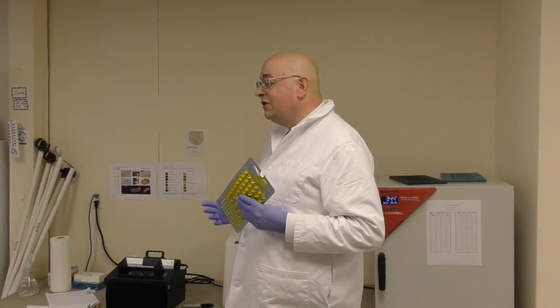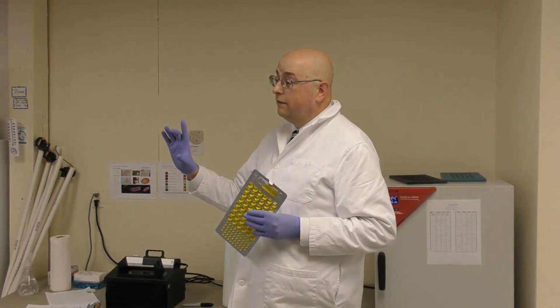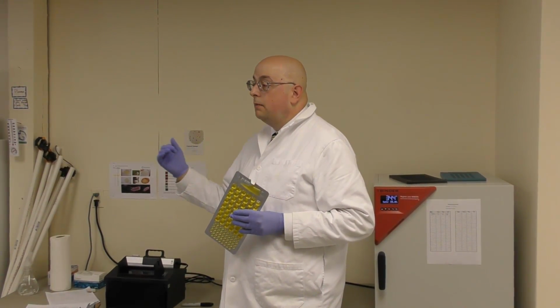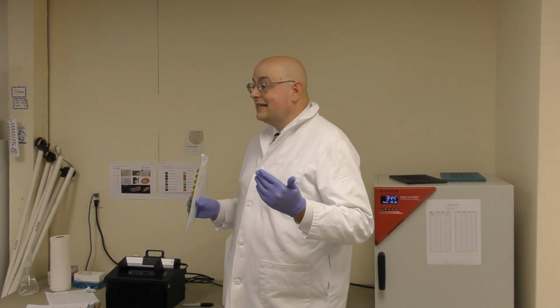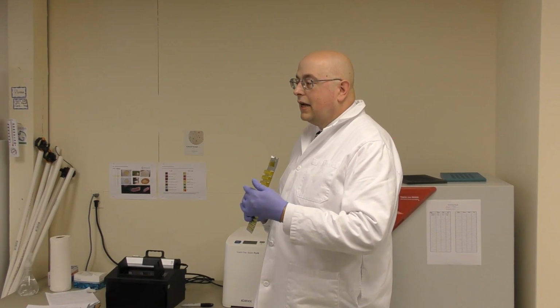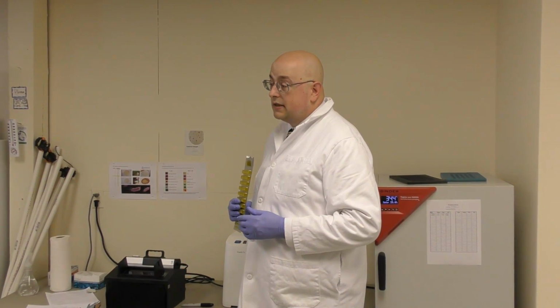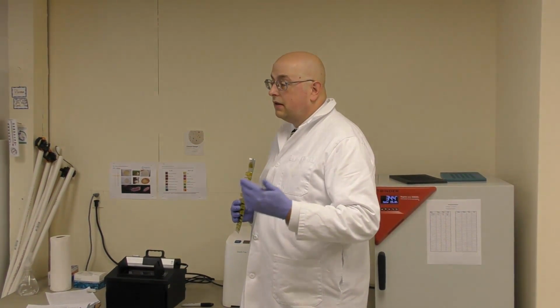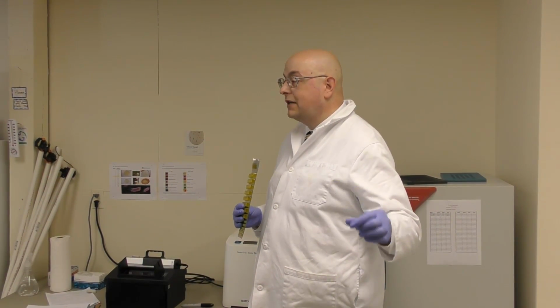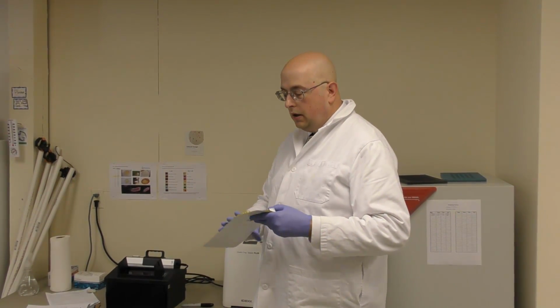Now, if for some reason you have to dilute, because say you got a bottle that was 3/4 of the way full and you had to add 20 milliliters, that's going to affect your MPN numbers. You're going to have to do a little bit of calculation. If I did 97 milliliters of sample and added 3 mils of blank water, it's going to be greater than 2,419.6, like 2,600, 2,700 bacteria, based upon how much bacteria-free water you've had to add. But most of the time, you shouldn't be doing that anyways. You'll just process a 100 ml sample.